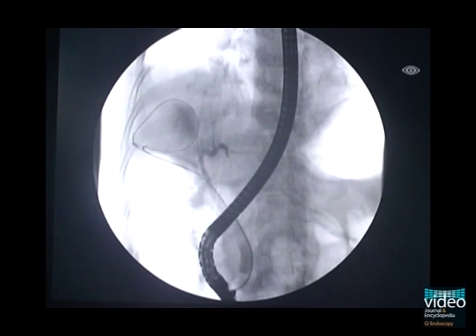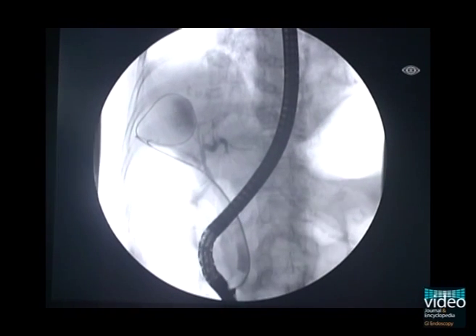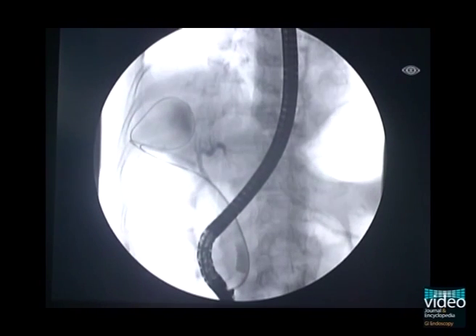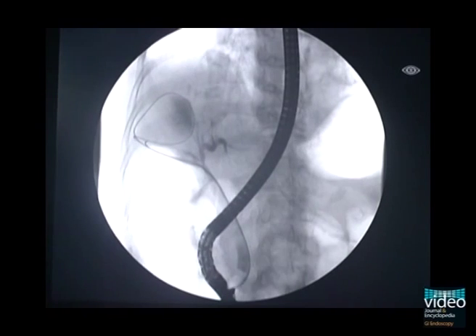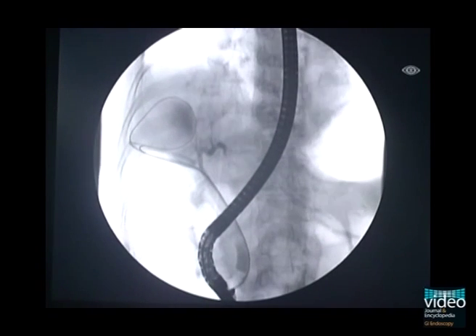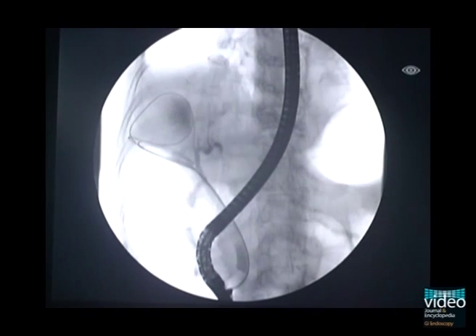Following withdrawal of the papillatome over the guidewire, a 7-French double-pigtail plastic stent was placed completely between the gallbladder and duodenum, as shown.